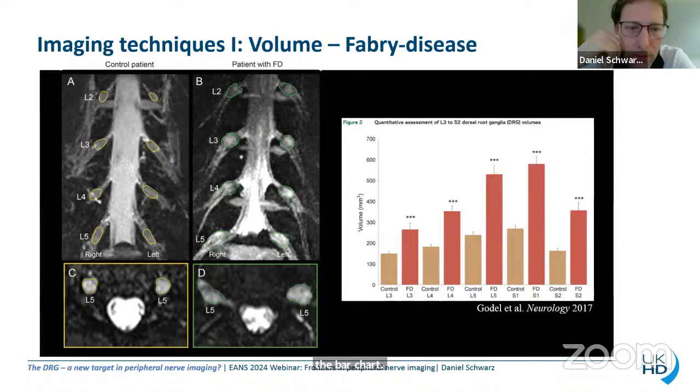Of course, it follows the rationale from what we know from the histology, but it was the first time that this can actually be evidenced in the human in vivo situation, and it represents the deposition of the sugar molecules within the stroma.